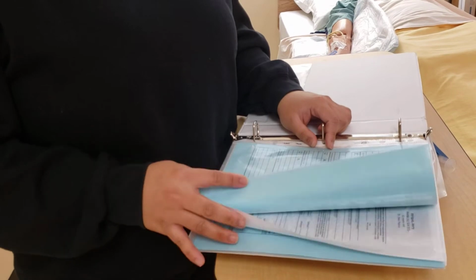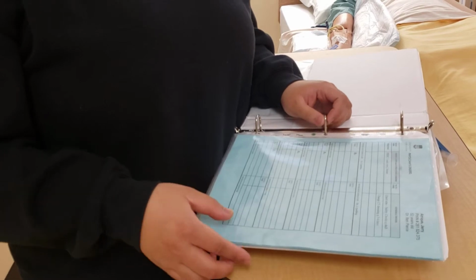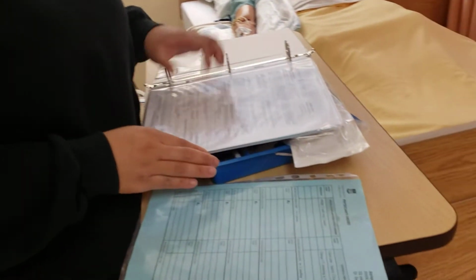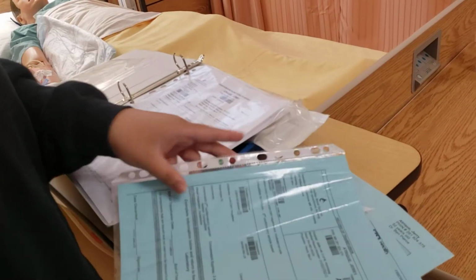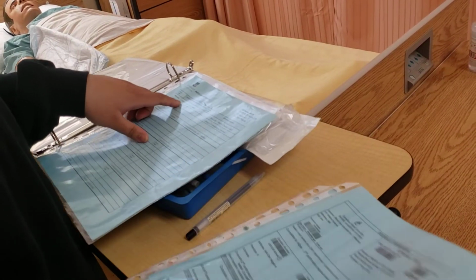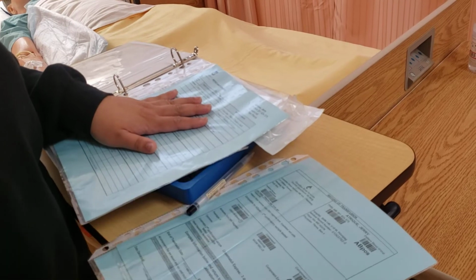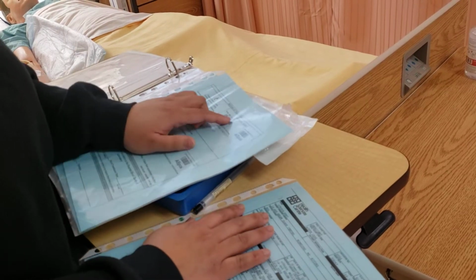And then next, I will ask a second nurse to do the checks with me. So for my first check, I'm gonna be checking the record of transfusion against the patient's demographic info. So we know from our physician's order, we're gonna administer 1 unit of packed red blood cells over 2 hours. And then for the first check, we're gonna check our patient's name and their PIN number.